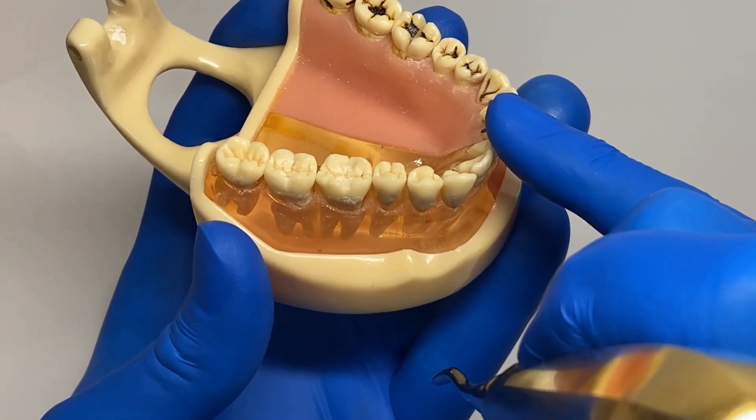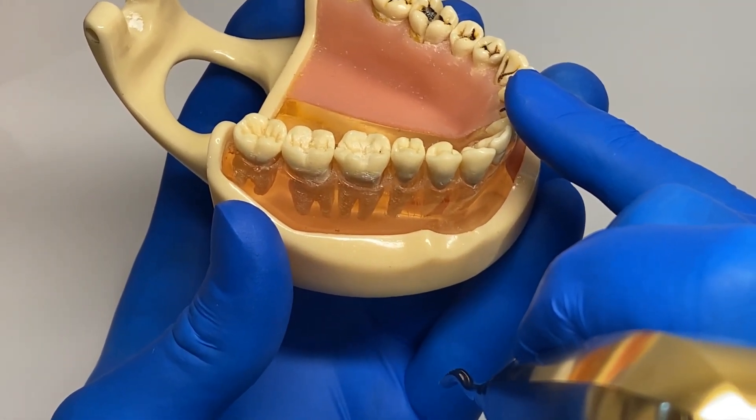As you'll see next, this method does not result in any loss of alveolar bone height.